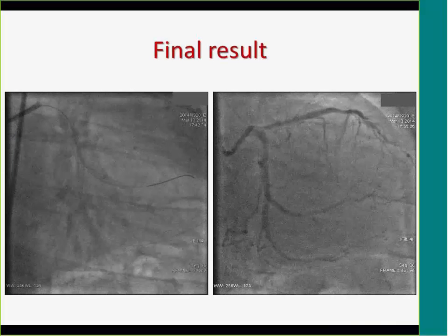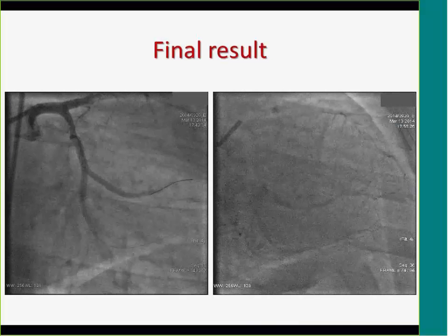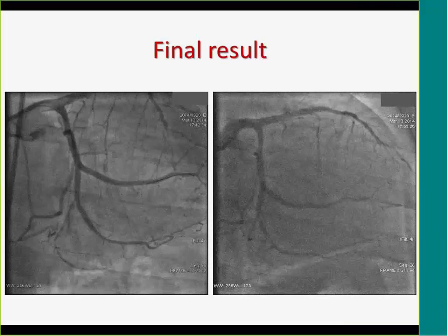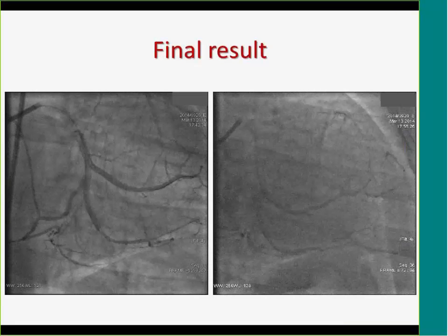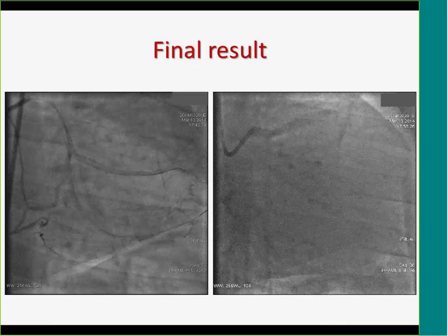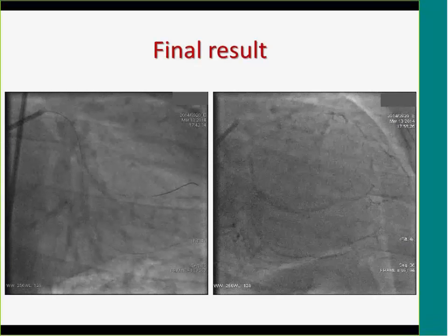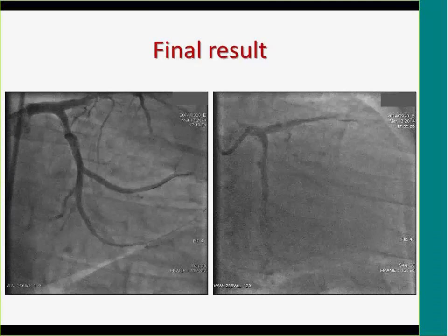Perfect. Well, thank you very much. I think these were 3 wonderful cases, actually, that illustrate the challenges of dealing with bifurcations and how to manage both the antegrade bifurcation as well as the distal cap bifurcation. So excellent tips and tricks. Imre, thank you so much for an excellent presentation.